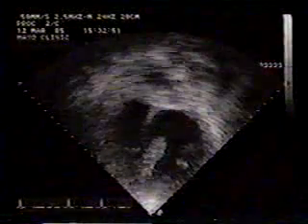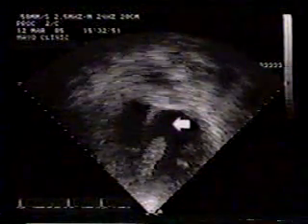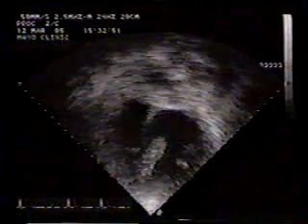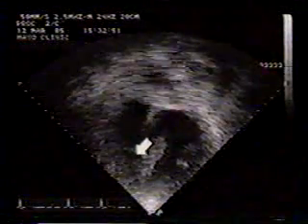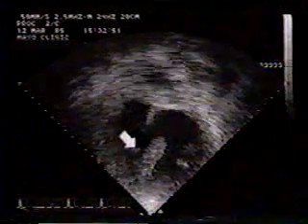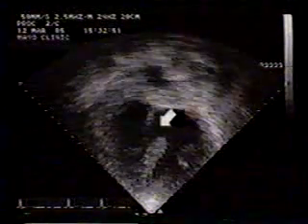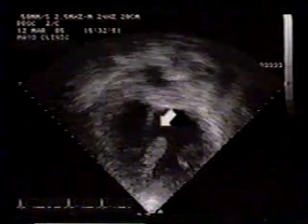With inferior scanning, ventricular septal rupture has been identified. The rupture involves the basal portion of the inferior septum, and the defect then tracks along the RV side of the septum to enter the RV at mid-ventricular level. This flap is RV endocardium. This type of VSD, which dissects its way distally through the septum, is classified as a complex VSD.